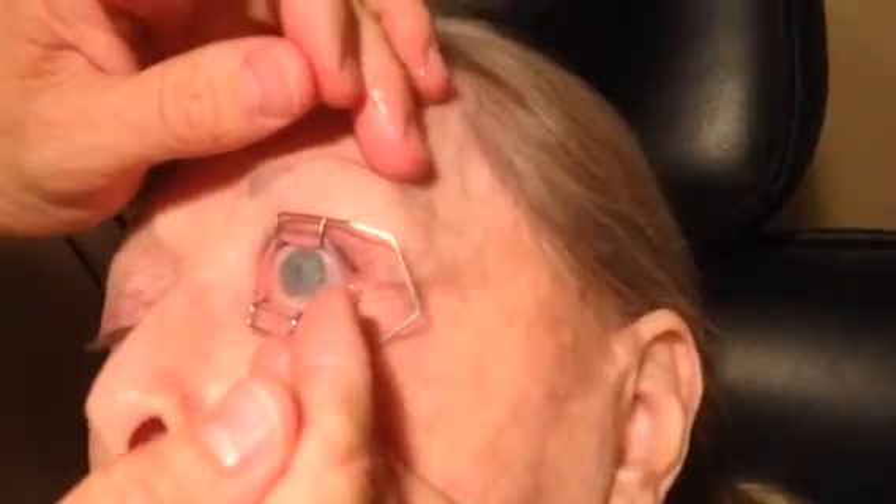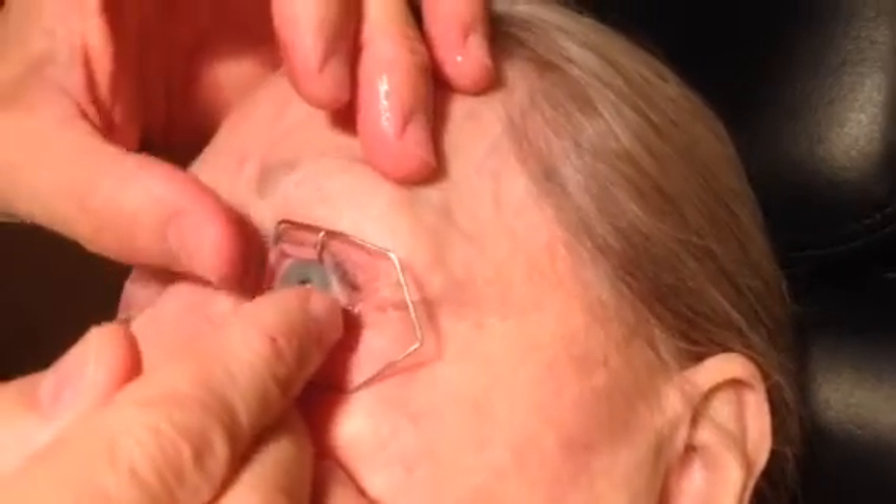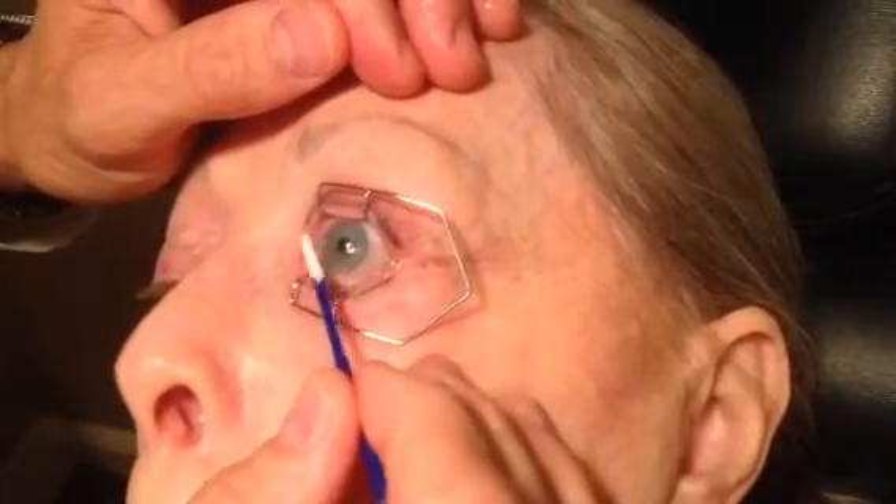It looks inside out to me. What do you think? It's dry on there nicely. Just deep breaths, okay? And then a simple bandage lens over top. Perfect. Good. Position it a little better. Get the bubbles out of it.